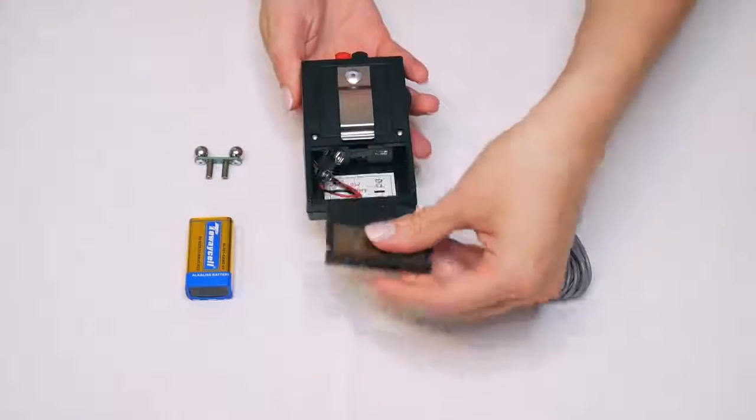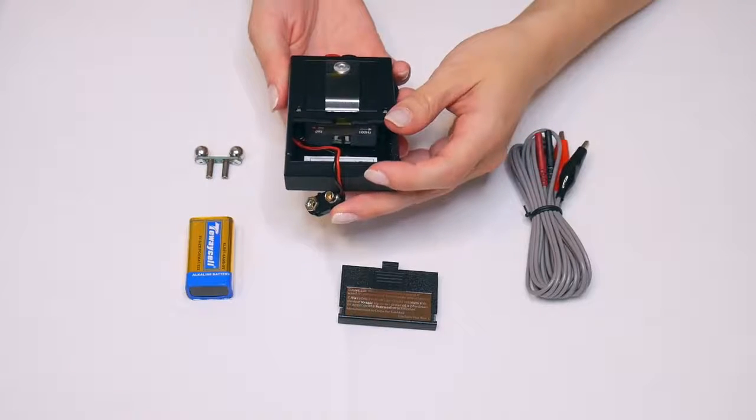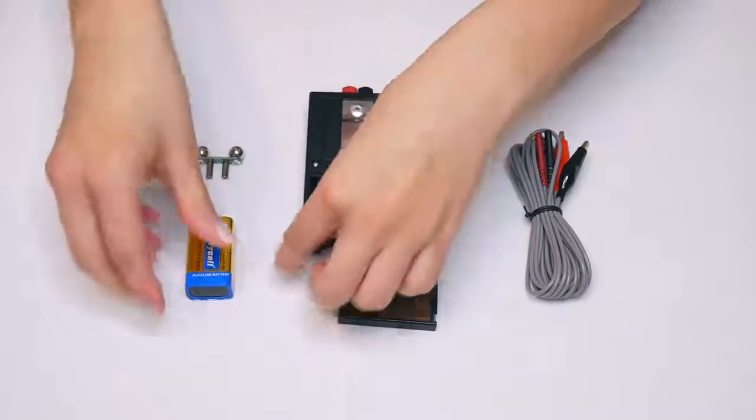If you remove the battery door, inside you have the option to toggle between 50 and 100 Hz. The Nerve Stimulators are preset at 100 Hz.